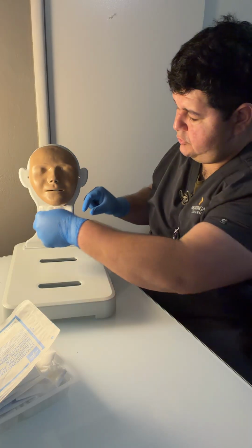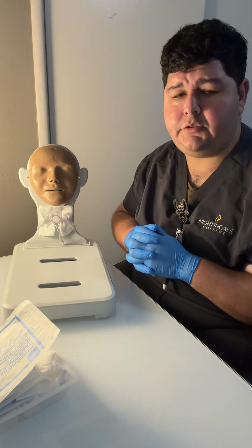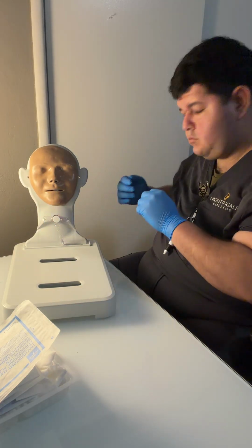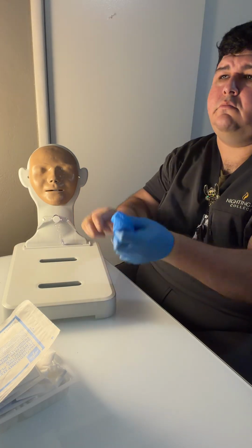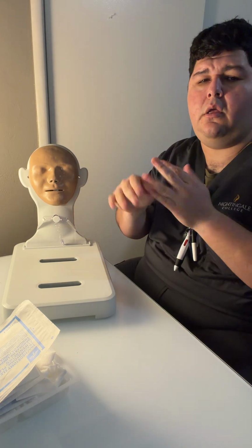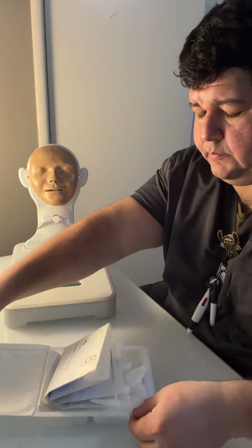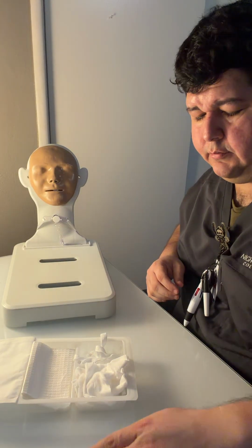Remove the oxygen source. And then I would remove the soiled trach dressing. I would then remove and discard the gloves as well, and perform hand hygiene. At this point, I want to set up our supplies. They are open. I want to open it up. Pull out my sterile gloves.